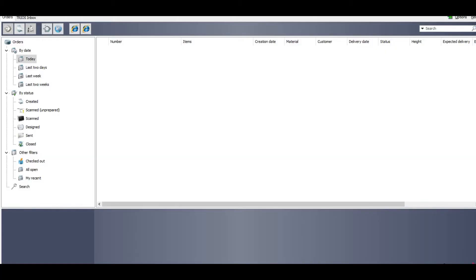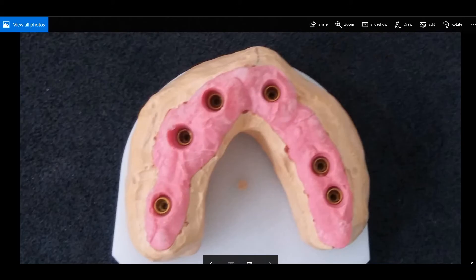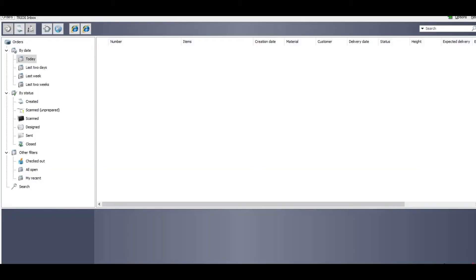Welcome to Digital Dental Technology Solution. This is the first video of the series on how you can design a full arch hybrid bridge with gingiva using the 3Shape dental system. Today I will show you how you can create an order for the full arch hybrid bridge with gingiva — for example, a case with six implants.